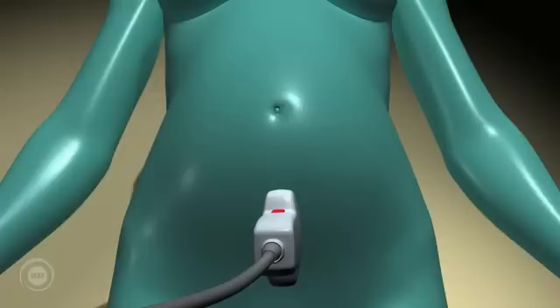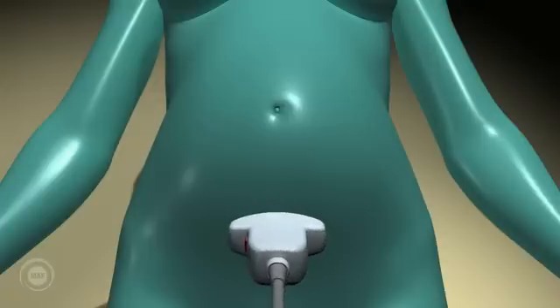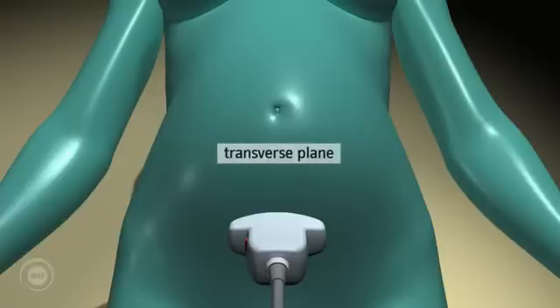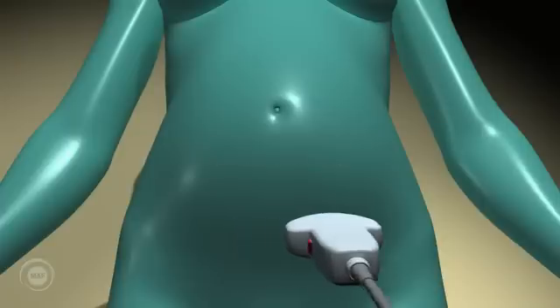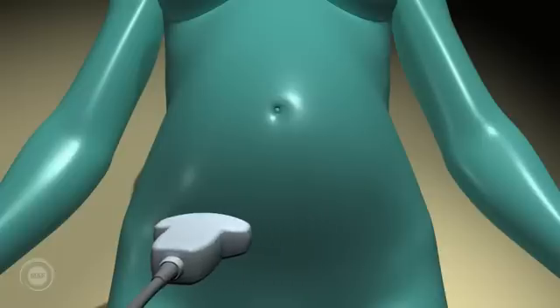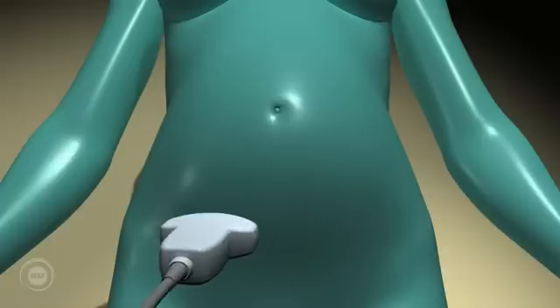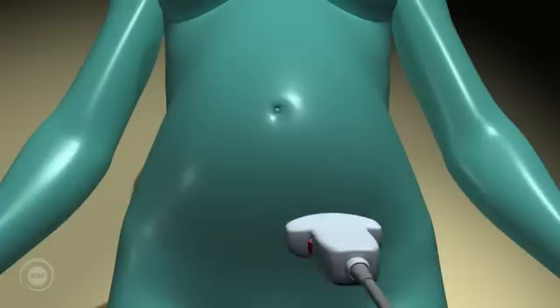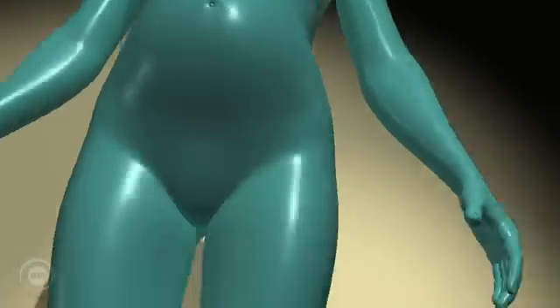Transverse. We then rotate the probe through 90 degrees so it's in the transverse plane. This means the long axis of the probe is lying across the mother. We then scan systematically across the mother's abdomen, taking slices crossways, giving left to right images.